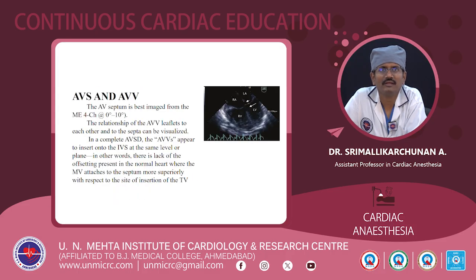Atrioventricular septum and atrioventricular valve imaging. The AV septum is best imaged from the mid-esophageal four-chamber view at the angle of 0 to 10 degrees. In this angle, the relation of the atrioventricular leaflets to each other and to septa can be visualized. In a complete AVCD, the atrioventricular valve appears to insert onto the IVS at the same level or in plane.